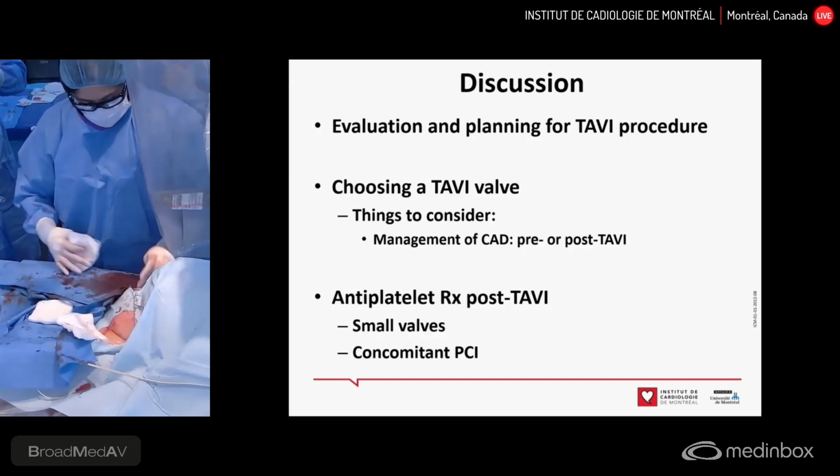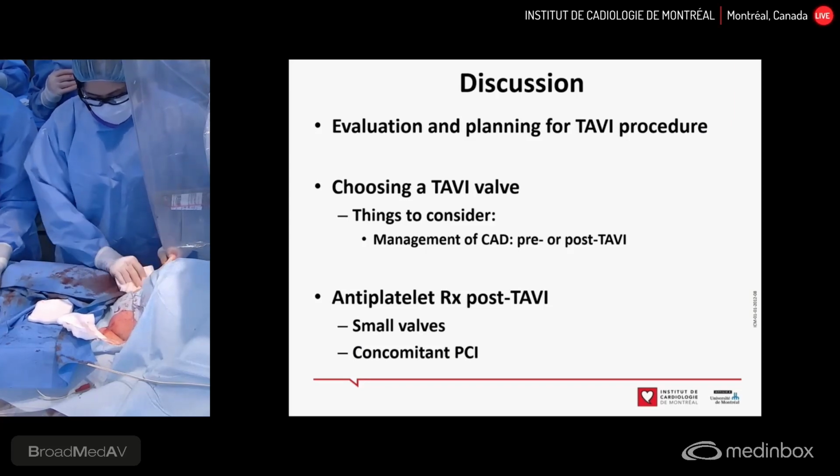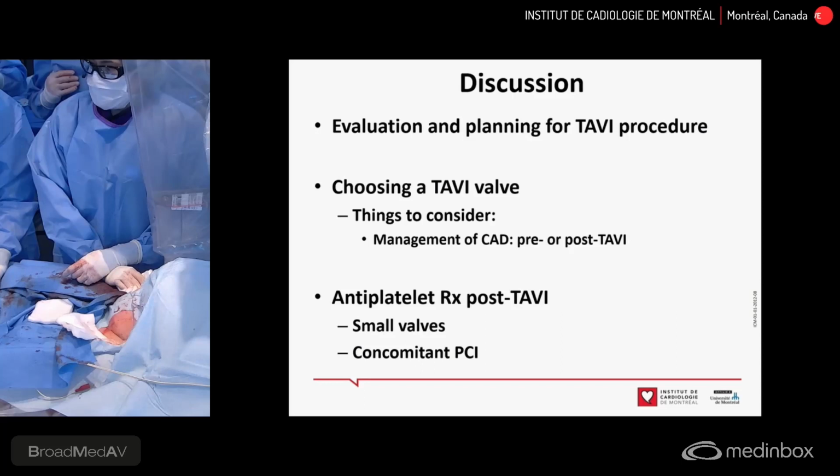So we have no bleeding. The groins look good. We've got an Angio-Seal on the left side. We have a MANTA on the right. She's got a previous hematoma from her procedure on Monday. But other than that, no bleeding.